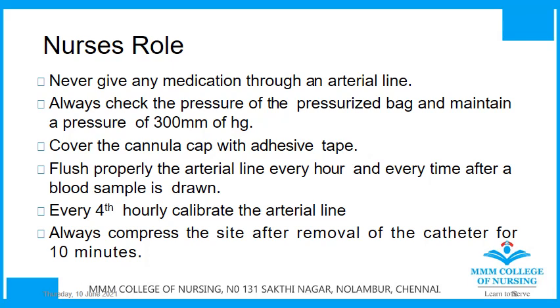Cover the cannula cap with adhesive tape. Flush the arterial line properly every hour and every time you withdraw a sample from the arterial line. Every 4th hourly, calibrate the arterial line. In each shift, you will have to do it once. Always compress the site for 10 minutes after removal of the catheter, as there is a high possibility of gushing of blood through the arterial opening.